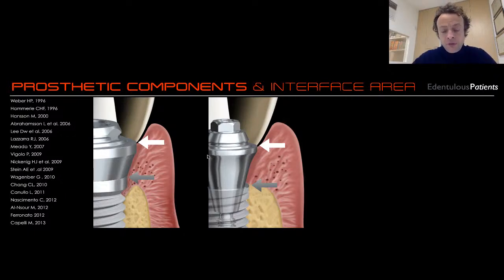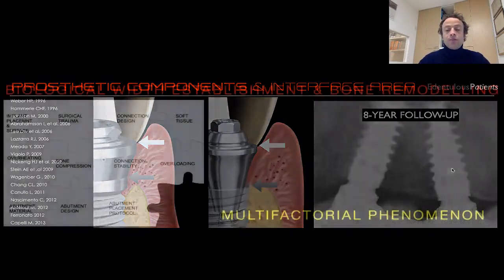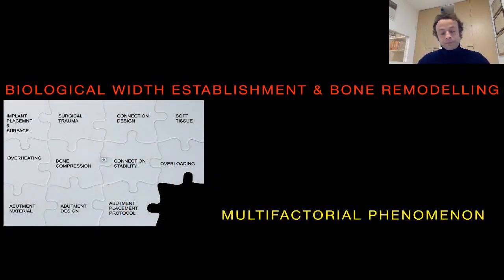Because if you place a prosthesis directly at the implant level without placing the multi-unit abutment, it means you lose the platform switching, because then the prosthesis will be flat to flat. So in that way, you can see how also in the full edentulous patient we can get this kind of really good integration at the bone level.